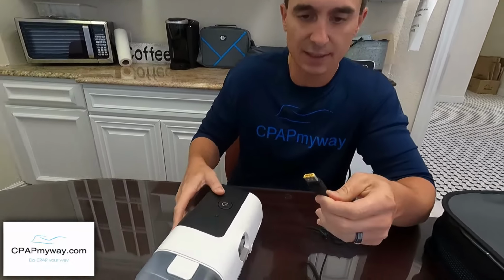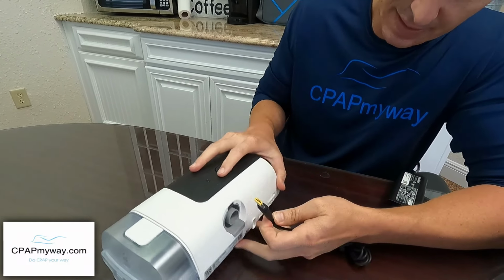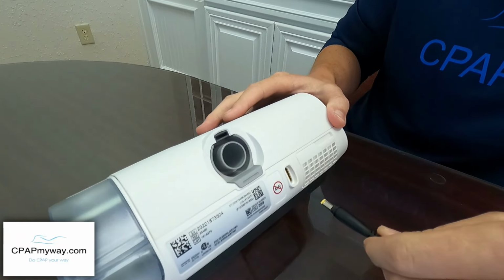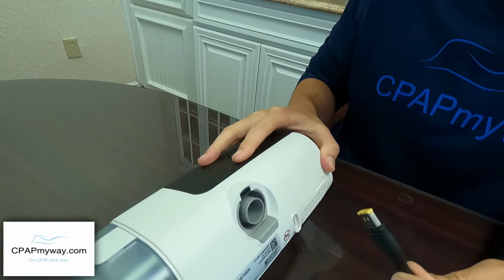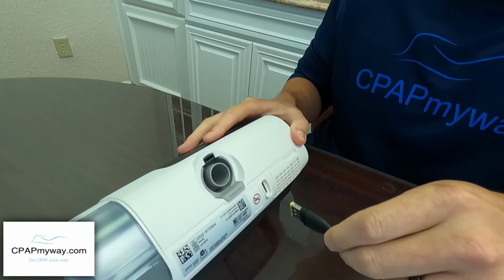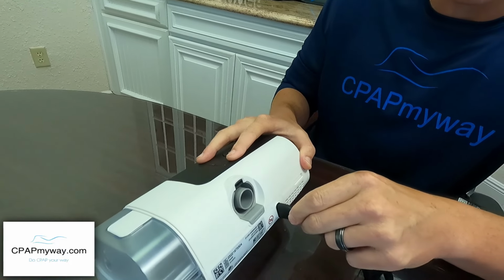All right, so if you look at the cord, it's obviously a little different than the AirSense 10, and it plugs in vertically on the back here. Okay, it goes in a particular way. It's got a little bit of a groove on it there, or a grooved corner. And so it has to go in the right way. If it doesn't go in easy, don't cram it.